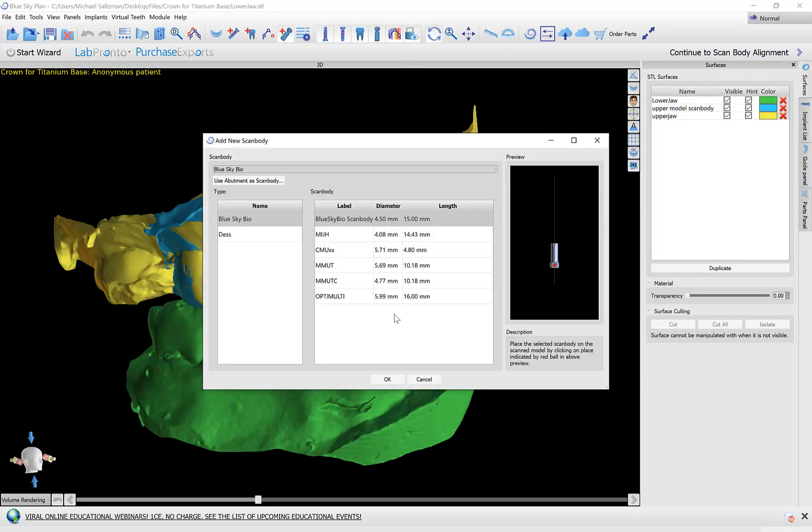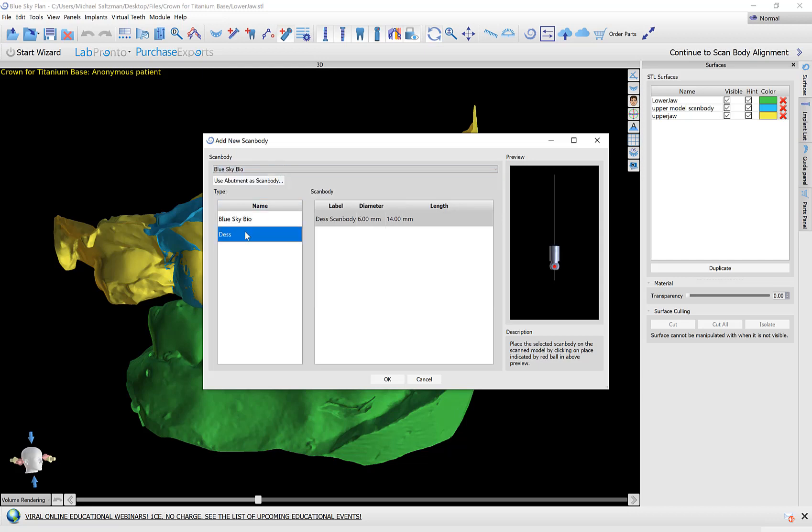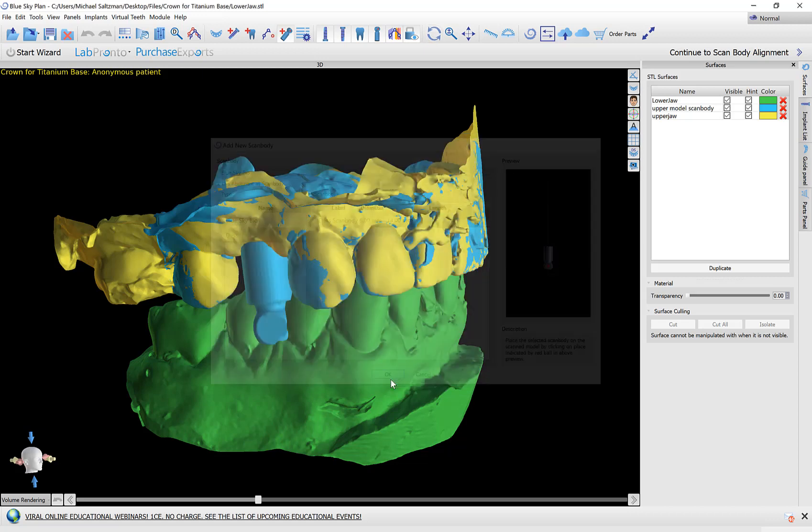Here I'm going to look in the library and select the relevant scan body. We also added in a new option here in case you scan the patient with an abutment protruding you could click use abutment as scan body. Select the relevant abutment from the list and use that as your scan body. At this point I'm pressing OK.